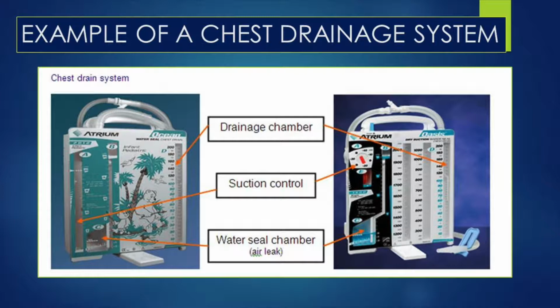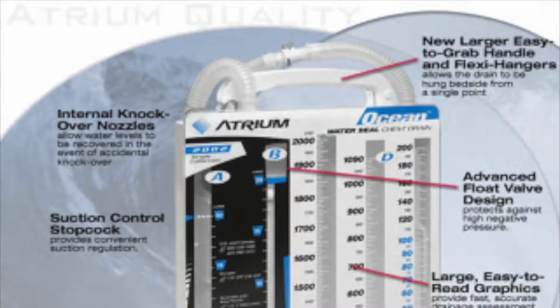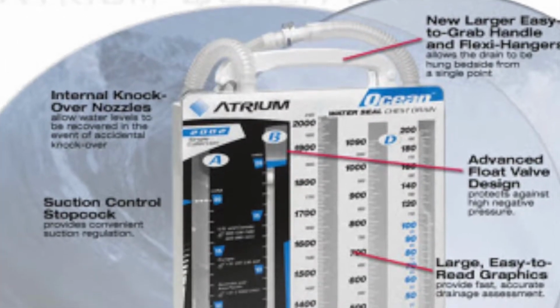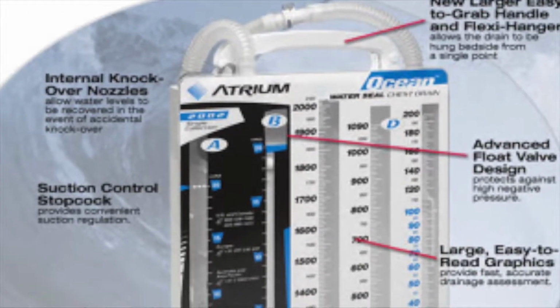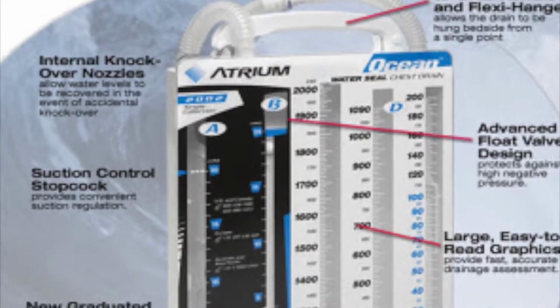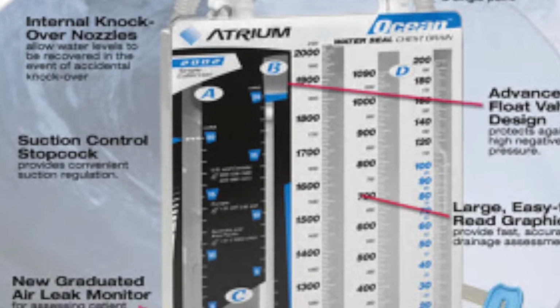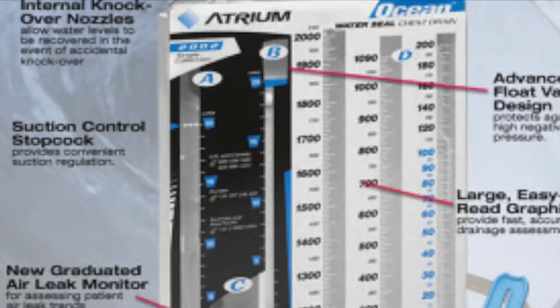There are 3 different types of chest tubes. The first chest tube is wet suction. This is regulated by the height of water in the suction control chamber. Depending on what the physician orders is how much water you'll fill up the chamber with. You will hear and see gentle bubbling, and the water will evaporate over time.